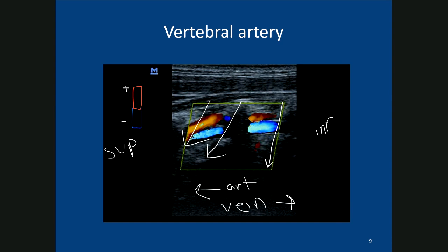So the way we receive a positive shift, or the only way we can receive a positive shift, is if the return frequency, the FE, is greater than the FO.